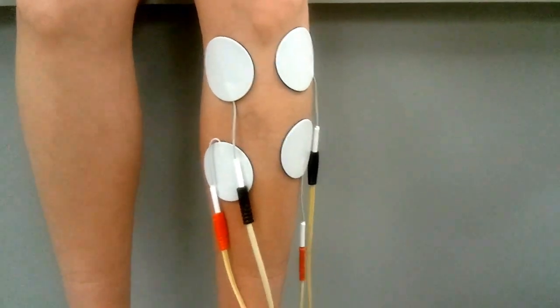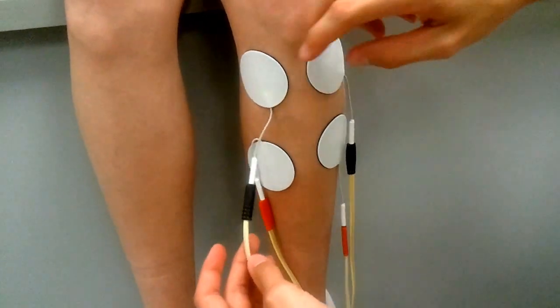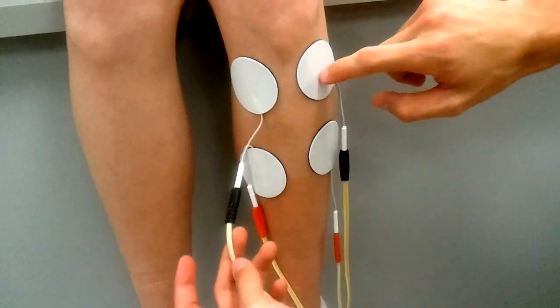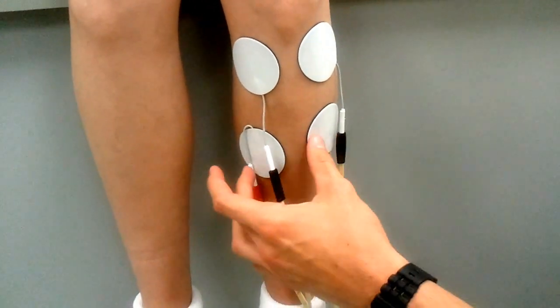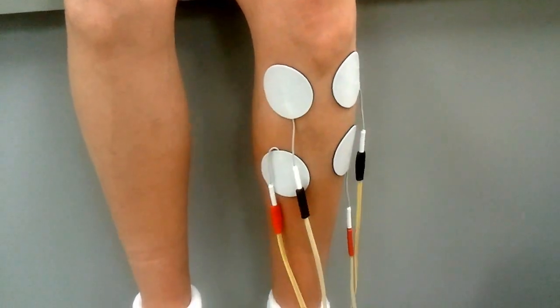This is just the IFC setup for tibialis anterior. Of course, quadripolar. You're going to cross the lead so you got negative, positive, negative, positive. You're not going to have any big contraction. This is used just for pain purposes.